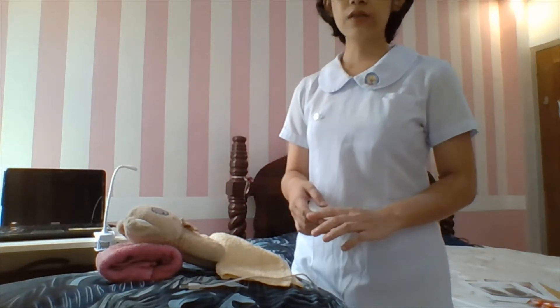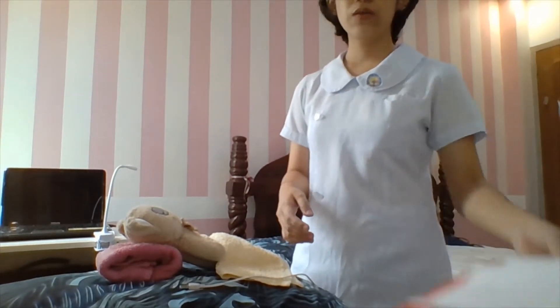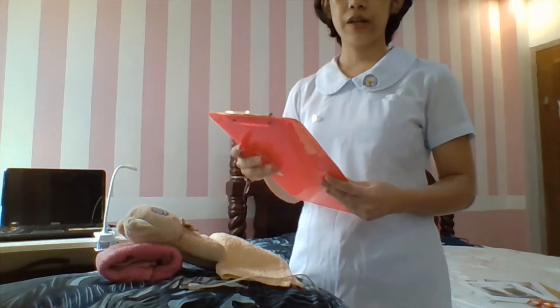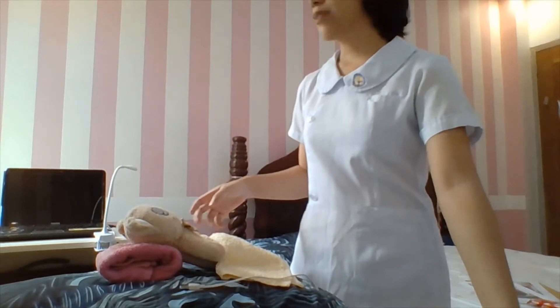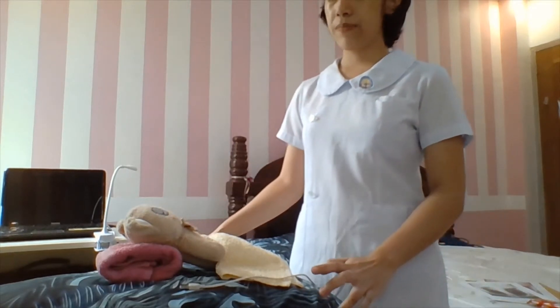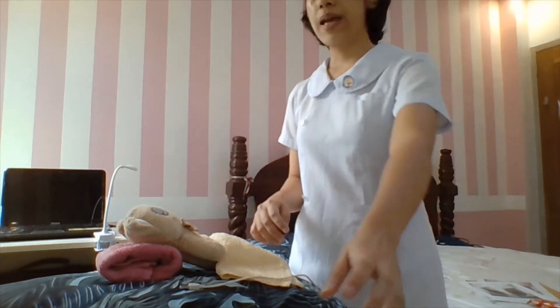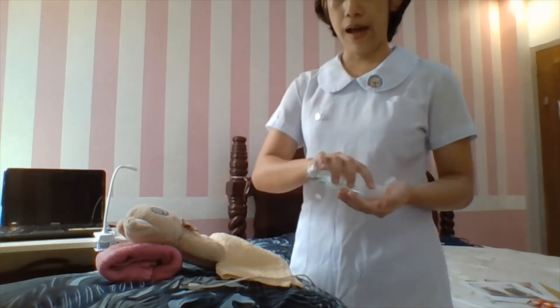We need to verify the order in the patient's medical chart for the electrocardiogram. We also need to gather the equipment needed at the patient's bedside to save time and effort, and perform hand hygiene using alcohol.